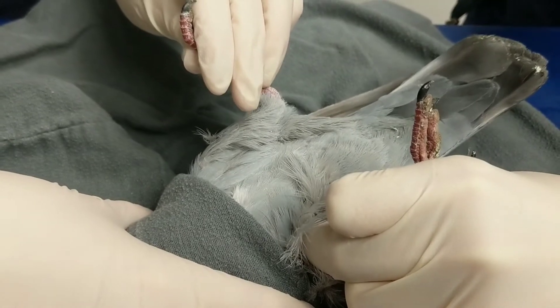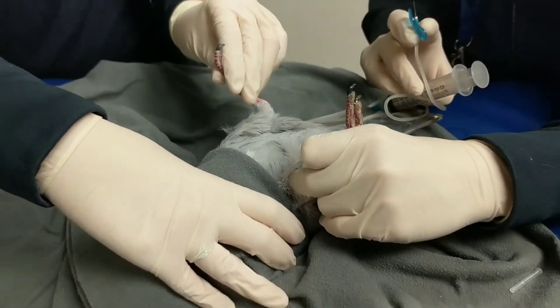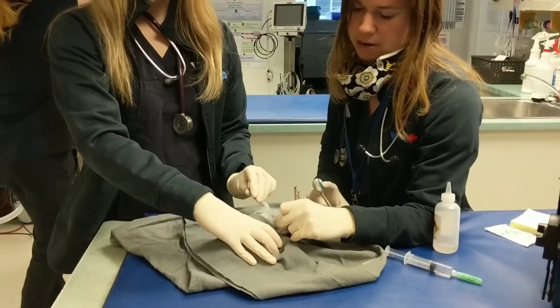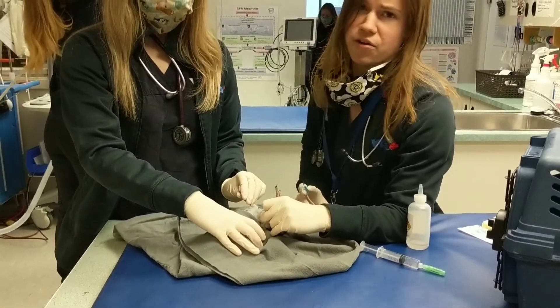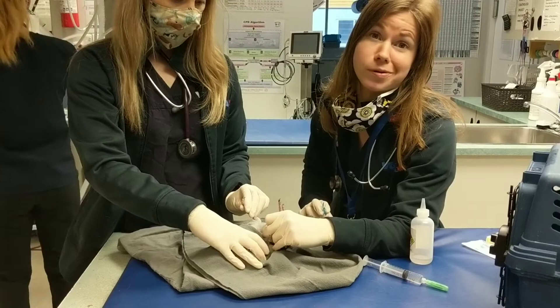It's basically the same procedure for the next limb, so I won't go through that on the video, but that's the general idea. And then that should stay overnight — that should hopefully help keep him hydrated overnight, and then someone will come and pick him up in the morning.